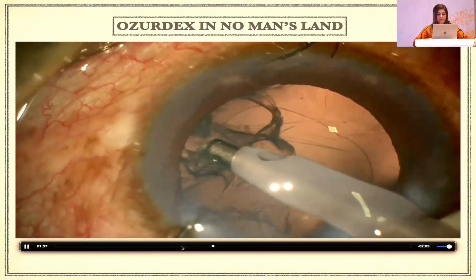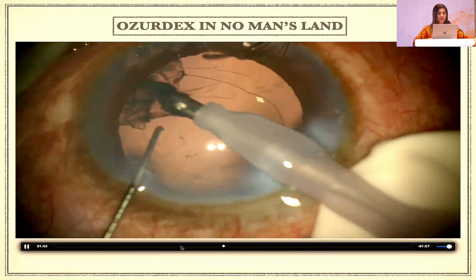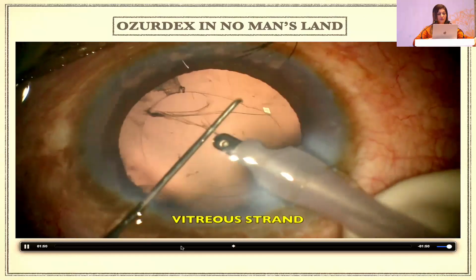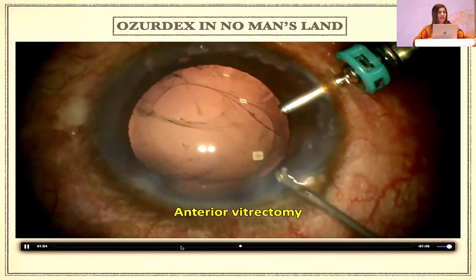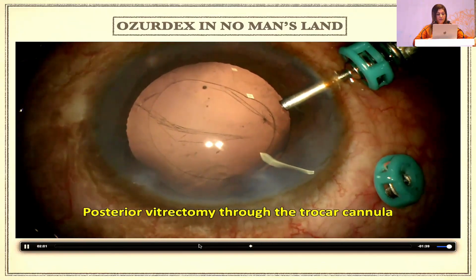most of the cortical matter is just removed, but yes, now things have started to show up that, okay, there is going to be a small opening out there, but it seems that there is no frank vitreous that has come up, but yes, there is an opening out there. So now this is a point you should not be fishing, because the vitreous is already there. So the best thing is to take up a vitrectomy cutter and try to do a vitrectomy.